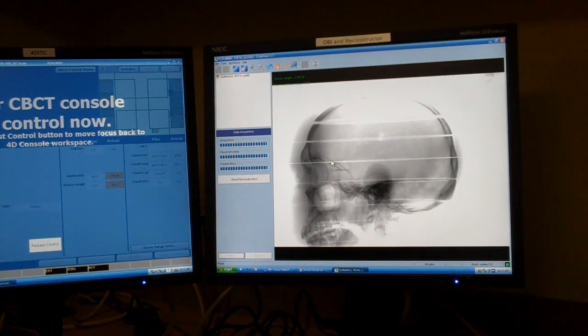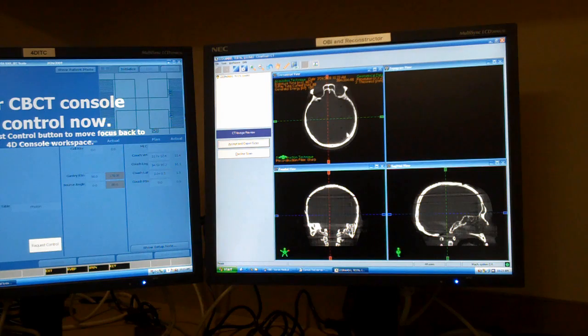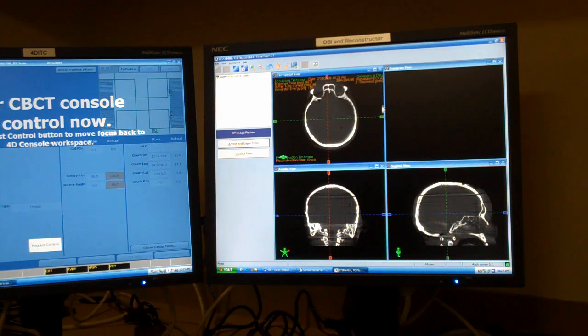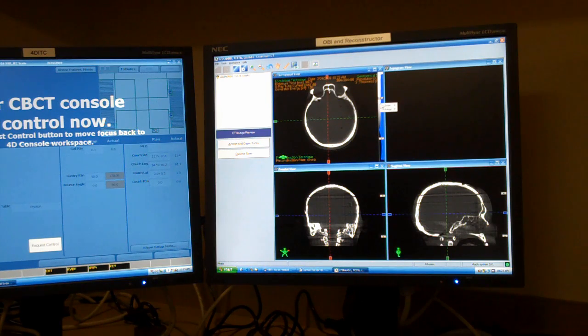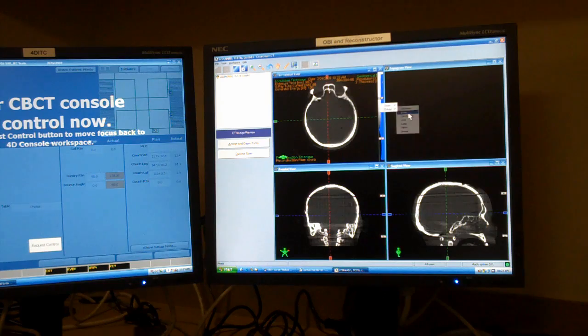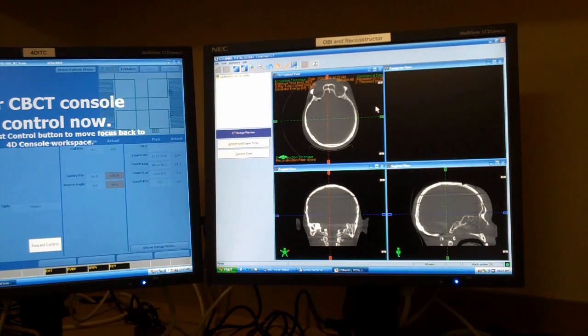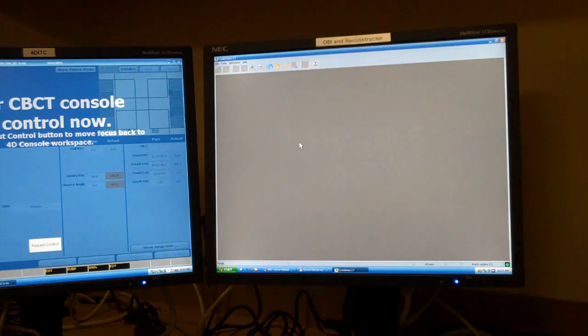And it's done. So now it finishes up the reconstruction, shows you a picture of everything. You can change the window level if you want. It has built-in presets, and then when you're happy, accept and export scan.